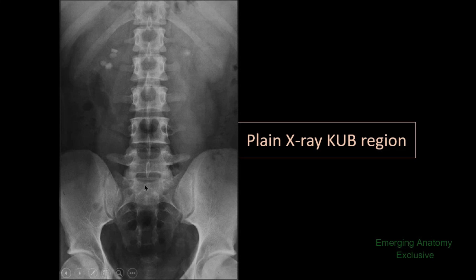Now, this image is for the ala of the sacrum. Here is the sacral promontory. And here is another ala of the sacrum on the other side. Here is the sacroiliac joint. This bone is the ilium — one of the bones of the hip bone.